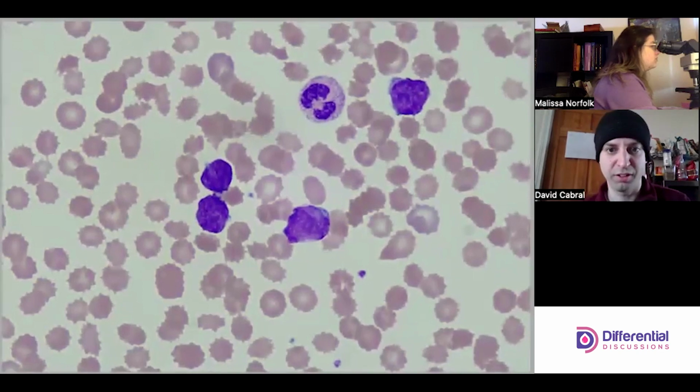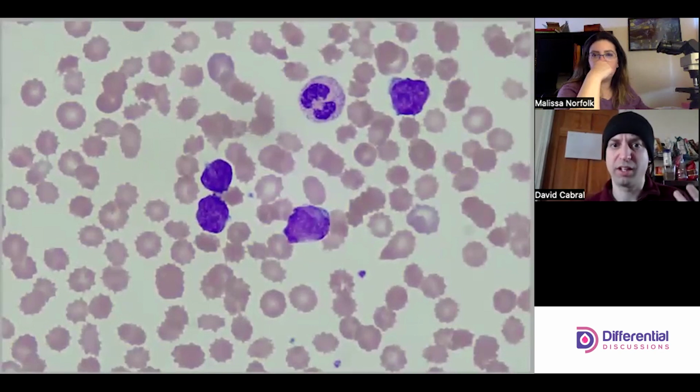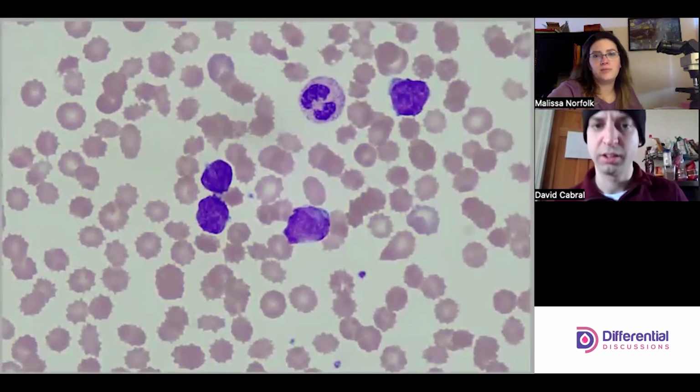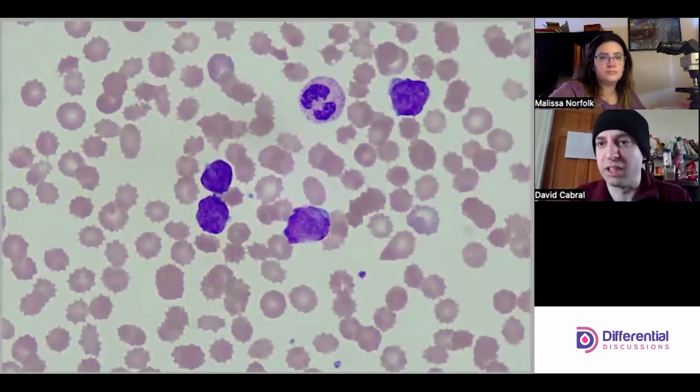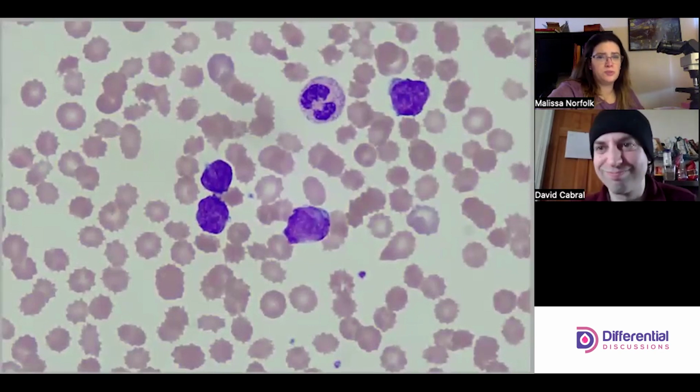We've got a rare neutrophil, and on the left there are some cells with scanty cytoplasm. Even normal resting lymphs you expect to see some degree of cytoplasm, so that's usually abnormal to my eye. The other two are bigger, spreadier.